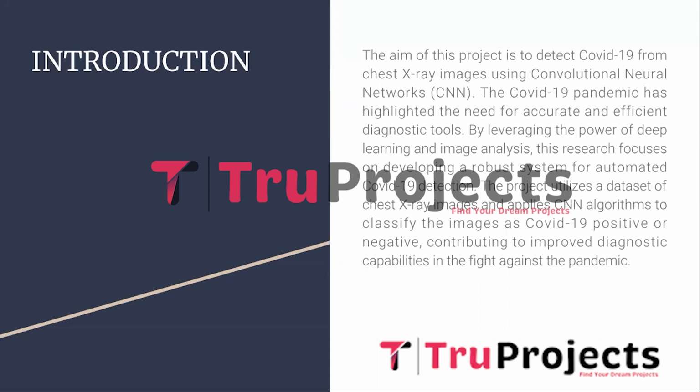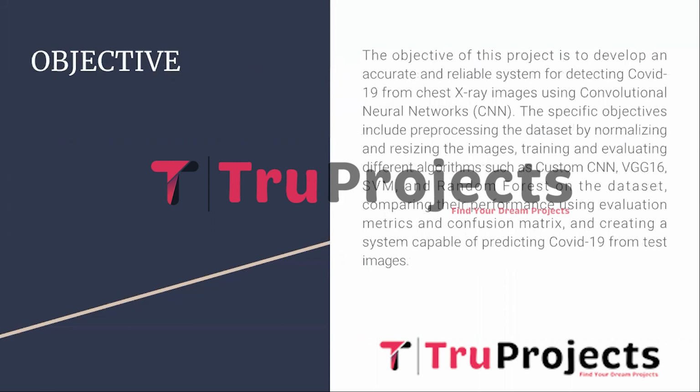By utilizing a dataset of chest X-ray images and implementing the CNN algorithm, the project aims to classify the images as either positive or negative for COVID-19, ultimately enhancing the diagnostic capabilities in the battle against the pandemic. The main goal of this project is to create a precise and dependable system that can identify COVID-19 cases by analyzing the chest X-ray images through the application of a convolutional neural network.